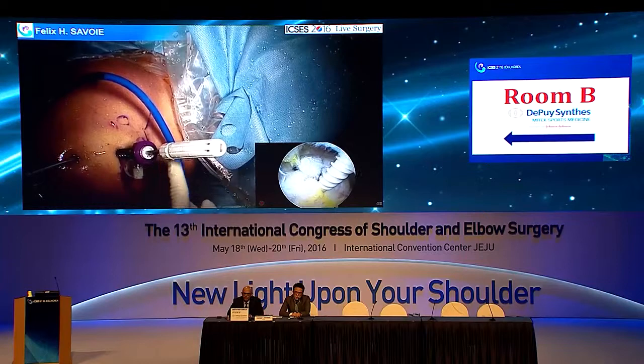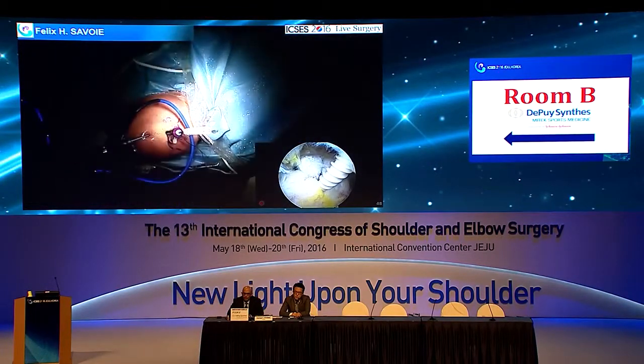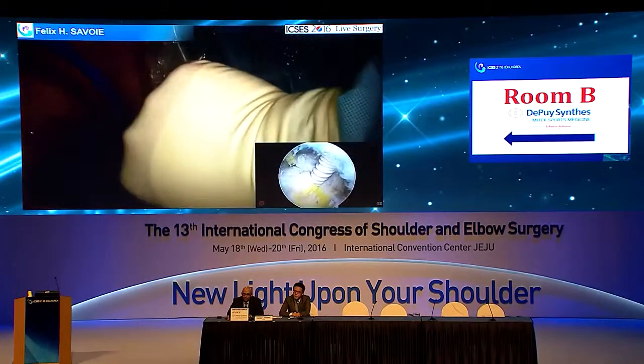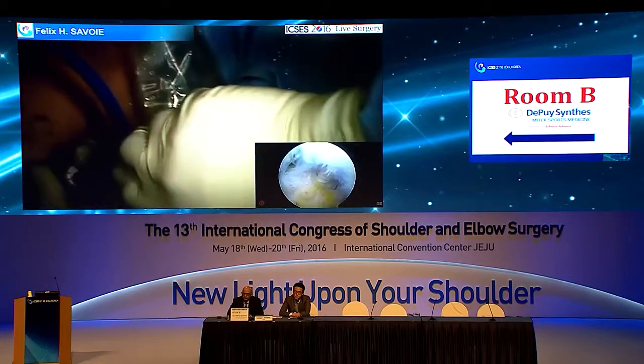Can we zoom? Okay. All right. So let's move on. So then when we get ready to put our anchor in, we push it in. We have to take all of these out, and then we'll screw it in.